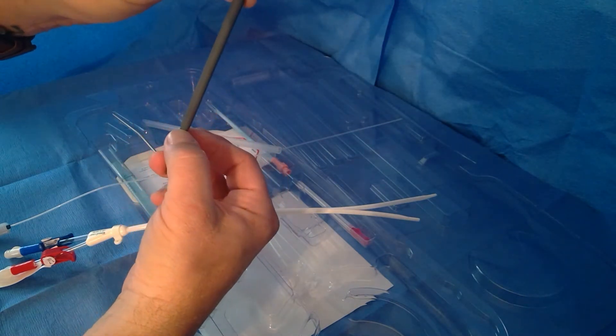Or a ledge. So if you put the peel-away all the way down, most of the time the tip of that peel-away is going to get you almost to the right atrium, if not the right atrium, on the right side. If you're on the left side, it'll get you pretty close depending on the size of the patient.